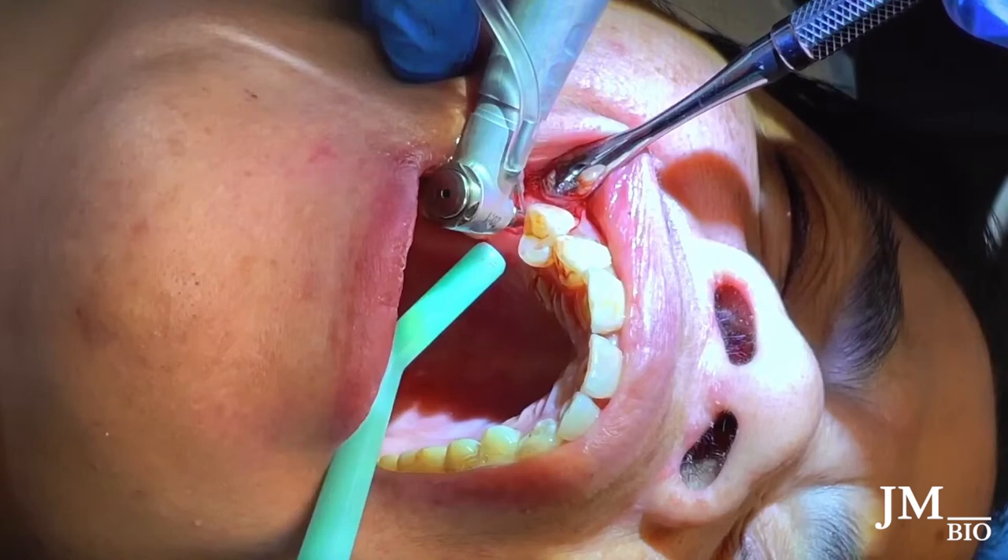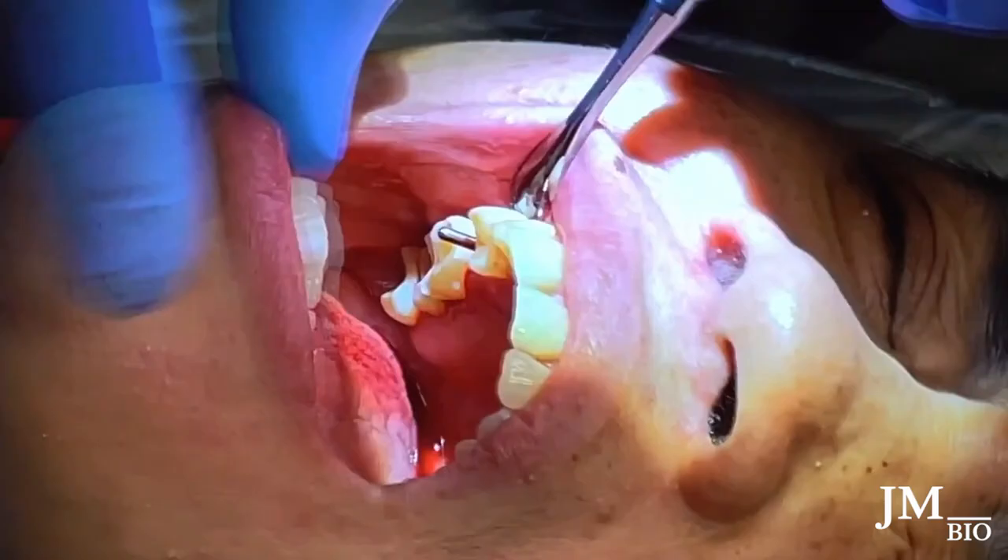I flip the parallel pin in again to check one more time. The patient bites down — they usually can't bite all the way down because the pin is too tall, but it gives you a reference. I'm right in the central fossa, which is the ideal location. I'm thinking from a crown-down perspective: where will my screw hole be, and where does the angulation need to hit the buccal cusp of the opposing tooth.